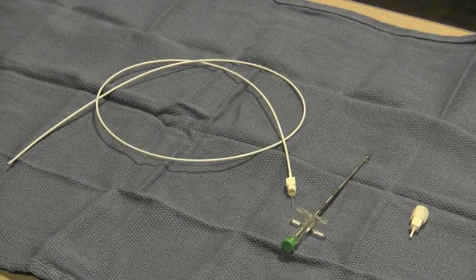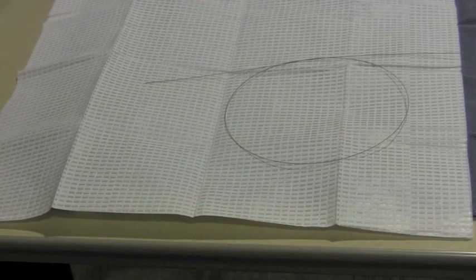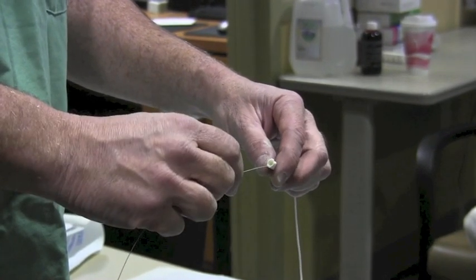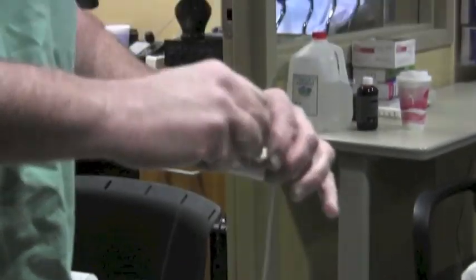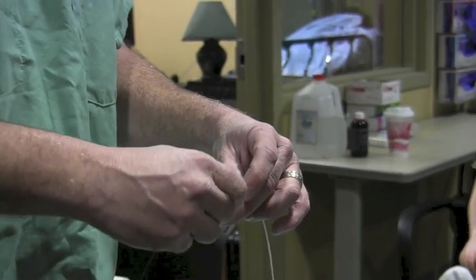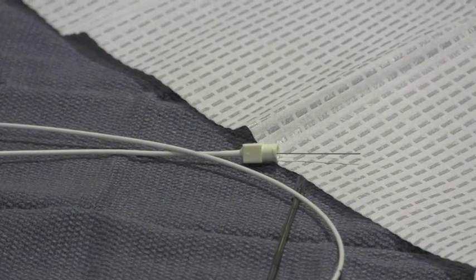Here is the lumbar catheter needle. Here's the wire that goes into the lumbar catheter. Here we are inserting the wire into the lumbar catheter. A lumbar drain can also be inserted without this wire within the tubing, but having the wire within the tubing makes passage much easier, especially in people with spine disease. Here's the catheter with the soft wire inserted.